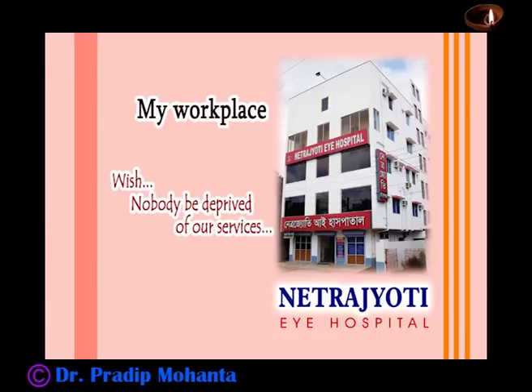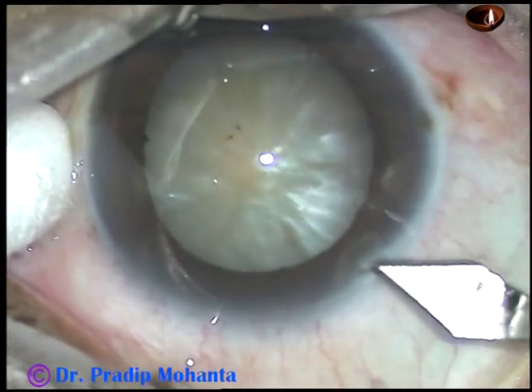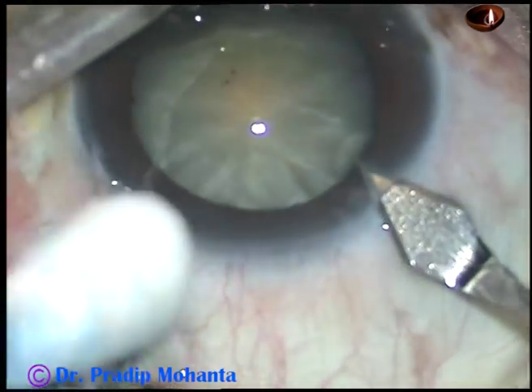Friends, welcome to my hospital at Ranaghat, India. This is phacoemulsification of a pre-intumescent cataract.